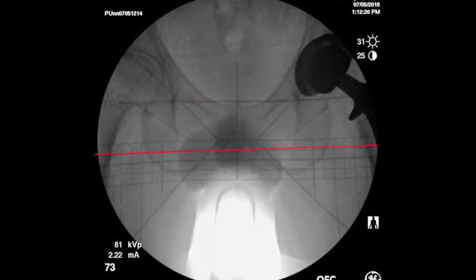But then if I look at how that line lines up with these other lines, these grid lines, one, that line tells me that my limb lengths are exactly the same when I know that my operative side is long intentionally. And two, you can see that this line I drew tends to be close to the operative side, but as it goes along here, the grid lines tend to distort away from that line that I drew and are no longer straight. And so over here, you're way off in terms of the position of the line that you drew with respect to the grid lines. So this image has a fair bit of distortion in it.